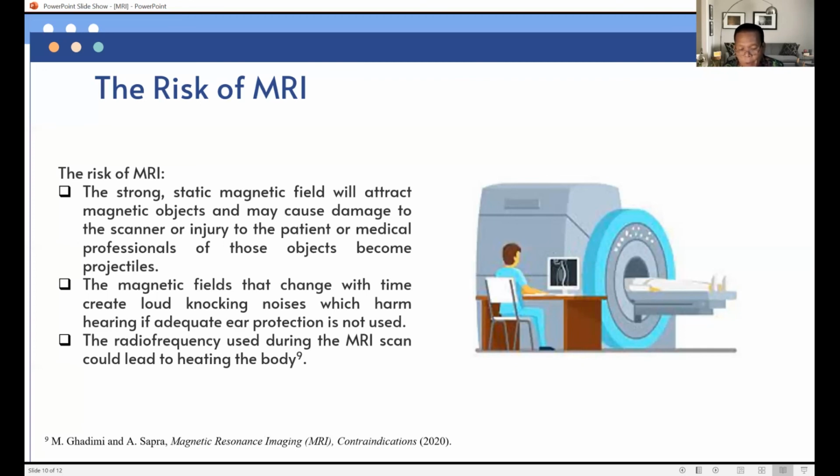A third commonly used sequence is the fluid-attenuated inversion recovery, or FLAIR. The FLAIR sequence is similar to T2W imaging except that the TE and TR times are very long. By doing so, abnormalities remain bright, but normal CSF fluid is attenuated and made dark. This sequence is very sensitive to pathology and makes the differentiation between CSF and abnormality much easier.